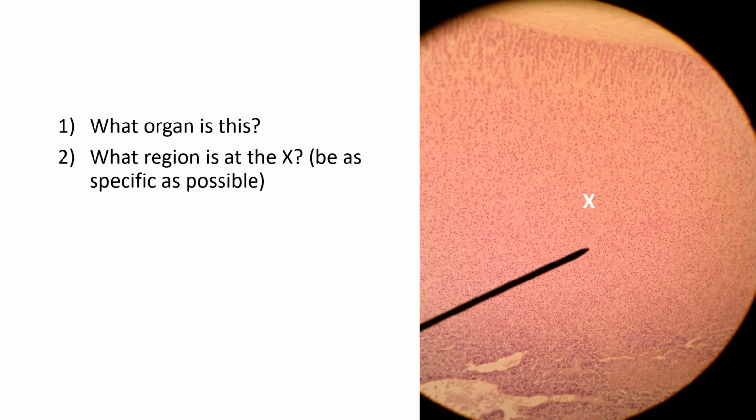So this is a really ugly picture. I'll give you a hint. There are multiple very subtle layers in here. Answers in 3, 2, 1. Or not.